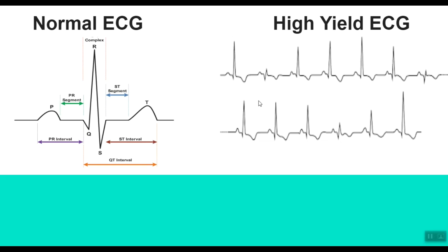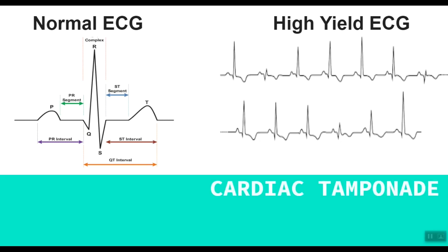The first thing you'll notice in this ECG is that the voltage of the QRS complex is not the same everywhere. The voltage is highest here, and then the voltage is lower. In other words, the voltage on the ECG is alternating between high and low. This phenomenon is called electrical alternans. Can you guess what the pathology is?